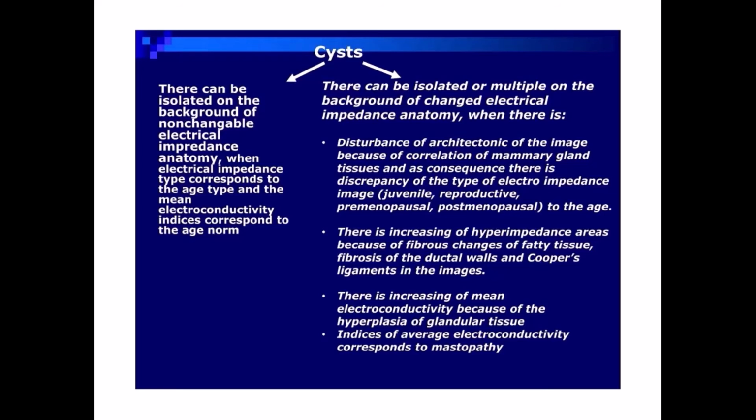There is increasing of hyperimpedance areas because of fibrous changes of fatty tissue, fibrosis of the ductal walls, and Cooper's ligaments in the images. There is increasing of mean electroconductivity because of the hyperplasia of glandular tissue. Indices of average electroconductivity correspond to mastopathy.